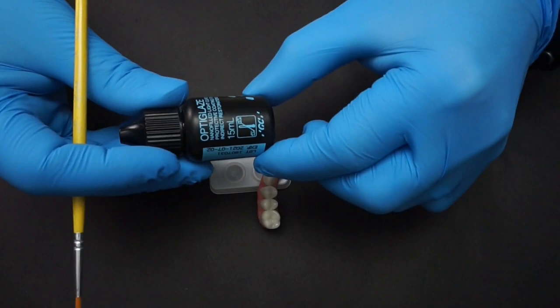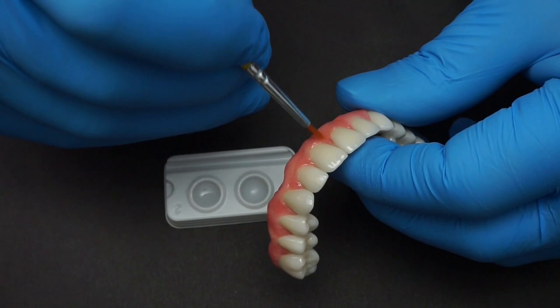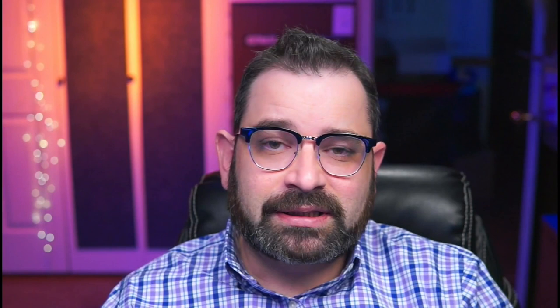Once you've completely cleaned and dried your prosthesis, apply OptiGlaze over the surface of the composite right at the CEJ of the crown. Make sure you're using a brand new or very clean brush because OptiGlaze does not tolerate any contamination. I'll also apply the glaze on the intaglio surface. Even though Trilore material is completely inert and does not react with tissue, I'm applying OptiGlaze to protect the margins between the composite and the Trilore. Once the glaze has been cured, you can either leave the restoration as is or polish the crowns and glaze to give a more natural shine.